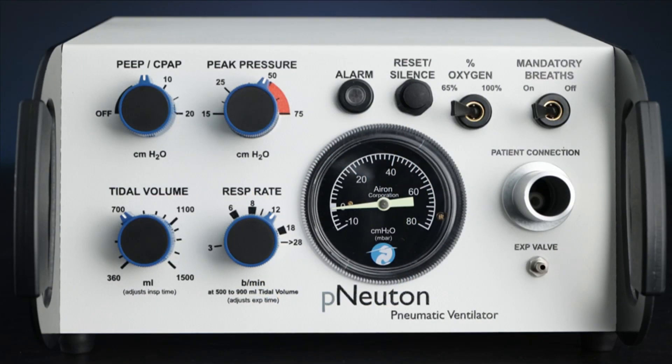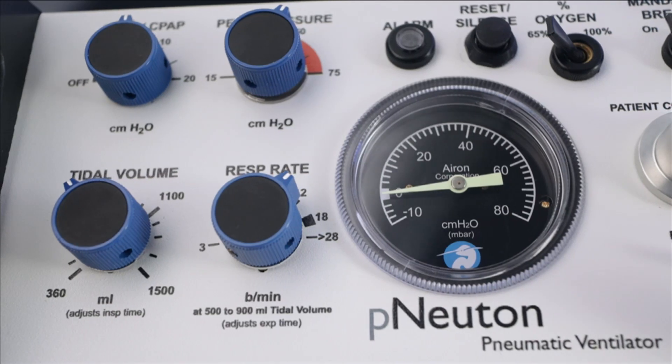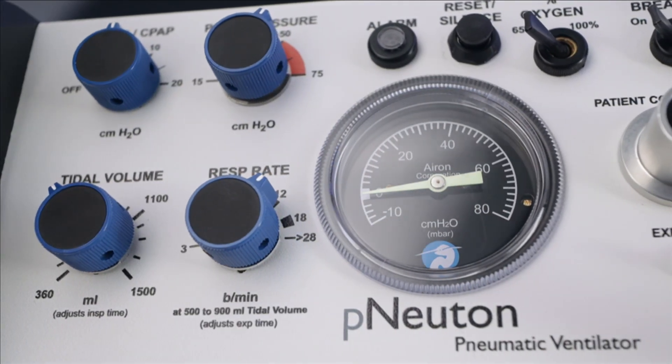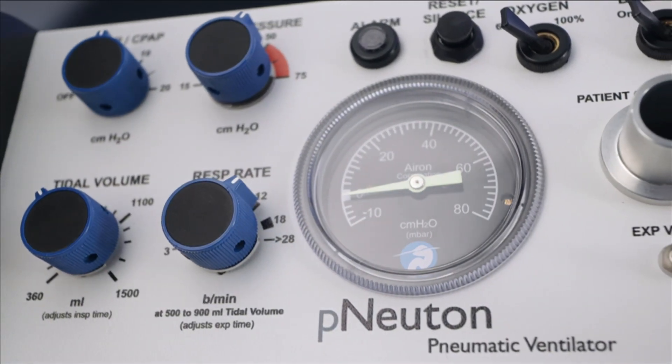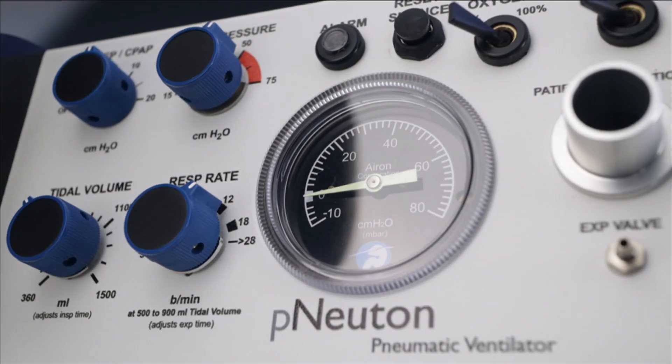Central to the front panel is the Manometer Pressure Gauge. This provides a visual indicator of patient pressure for the CPAP/PEEP and the delivered airway pressure for each breath. The Manometer shows pressure in the patient circuit as it leaves the ventilator.